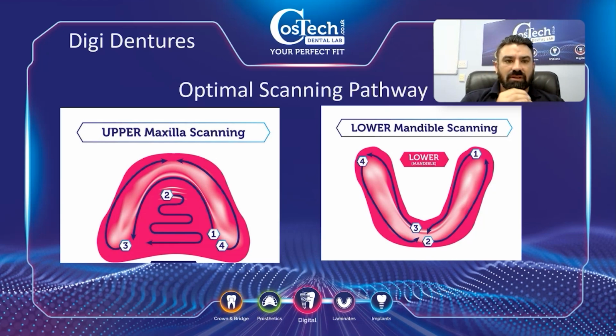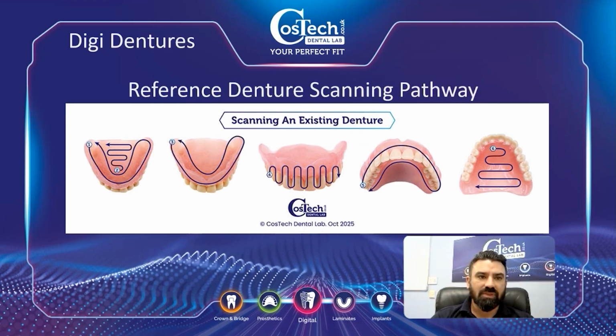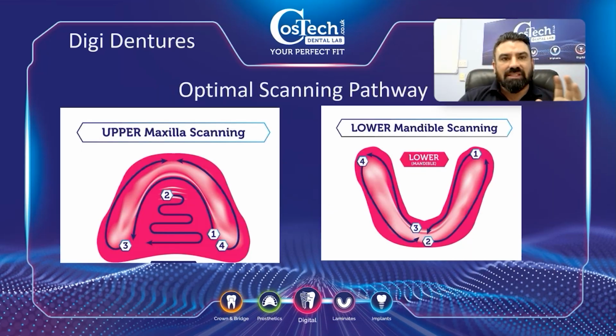That point between 2 and 3, the anterior region, becomes the main point. If you're scanning and it loses where it is, that becomes your reference. Just go straight back, it's easier to access than keep having to go back, and it's more comfortable for the patient. If you've got patients with existing teeth, you can pretty much scan the same way as you do with a crown and bridge. We have got that on the website as well. It's got a few scanning tips, but what works for you, as long as you're getting good detail, that's all we need.